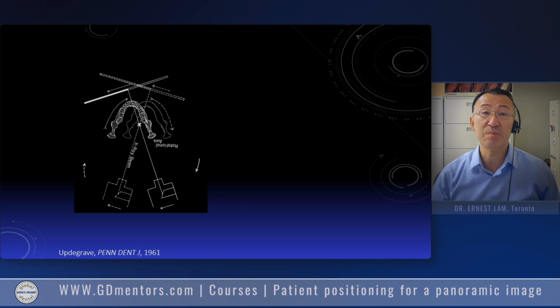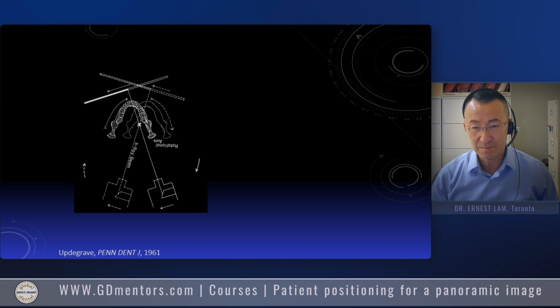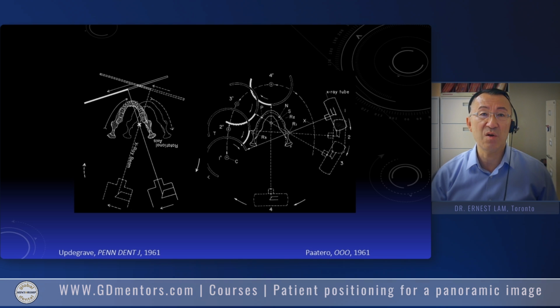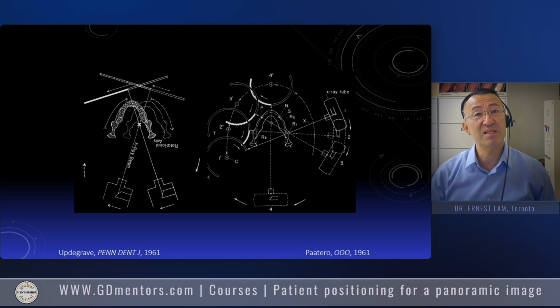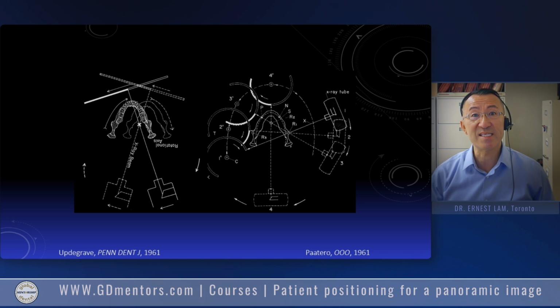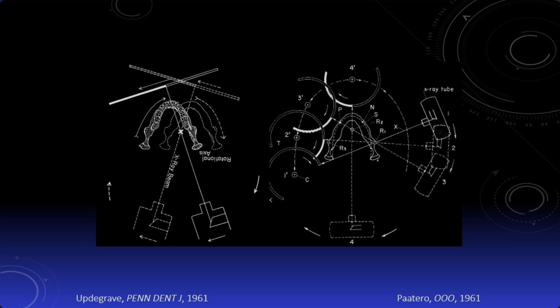There was a physical repositioning of the patient, and then the image continued on. But more modern day panoramic systems make use of almost an infinite number of these pivot points. And so today, when you look at a panoramic radiograph, the image looks virtually seamless because of the many, many pivot points that are created around the arch.